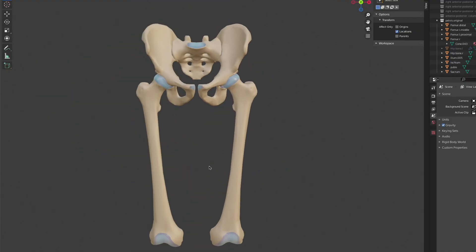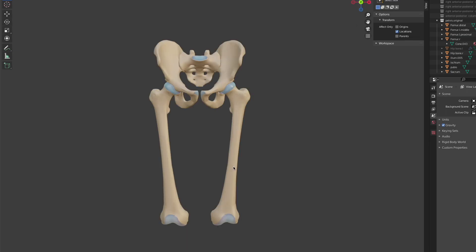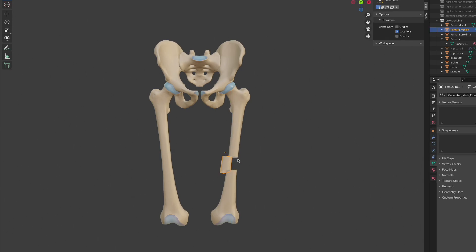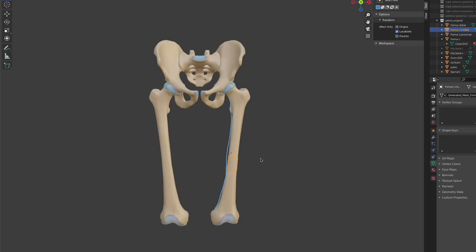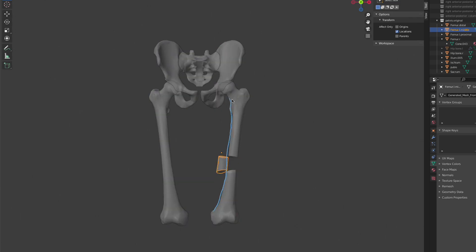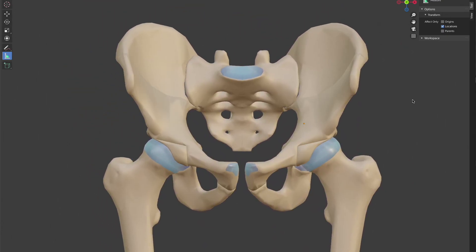Before explaining how to identify fractures in these different parts on x-ray, let me reiterate the basic principle of looking for fractures. The most important and useful way to look for fractures, especially acetabular fractures, is to learn how to identify important and normal anatomical lines. Using the femur as an example: if we draw a line along the medial edge of the femur, which is usually smooth, a fracture causing a fragment to displace medially would disrupt that line, showing a jagged rather than smooth contour.